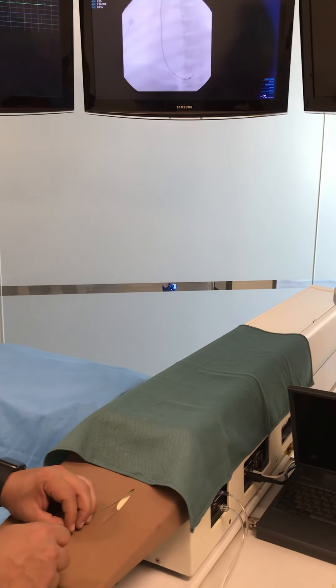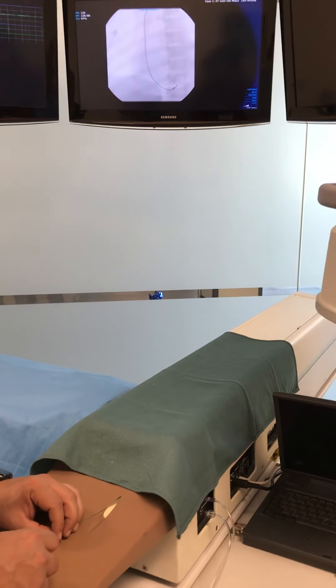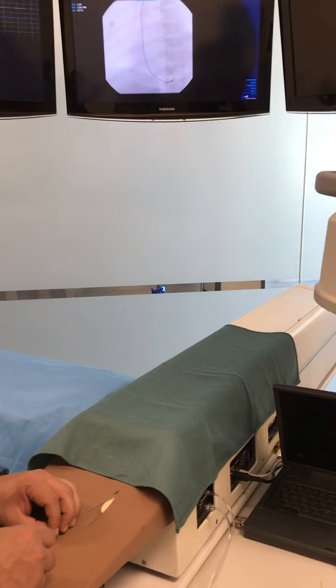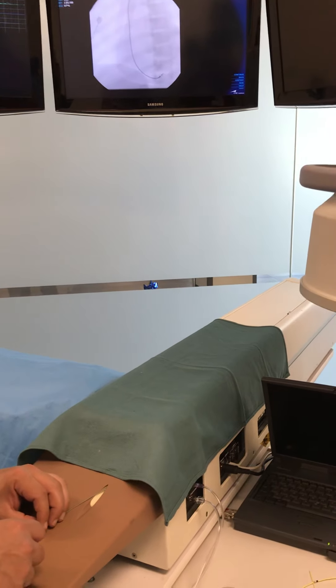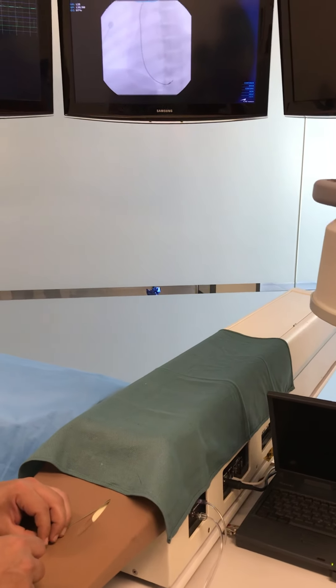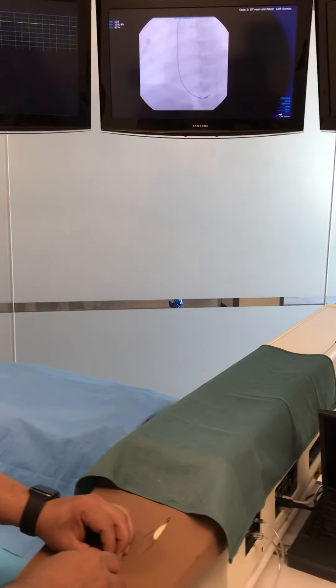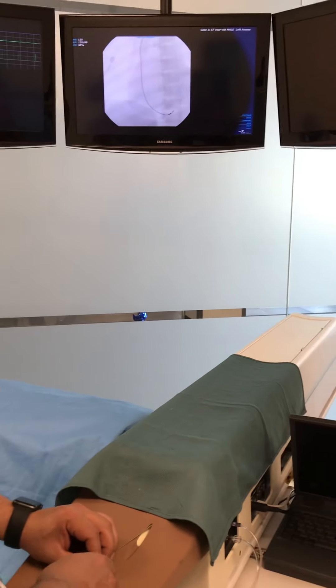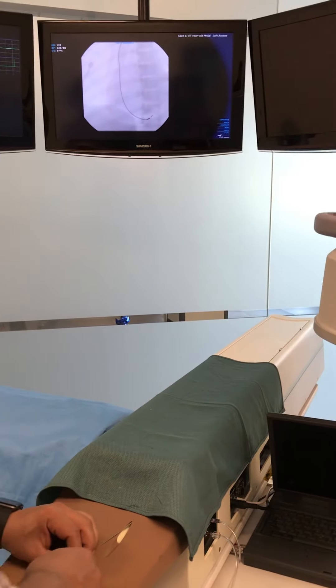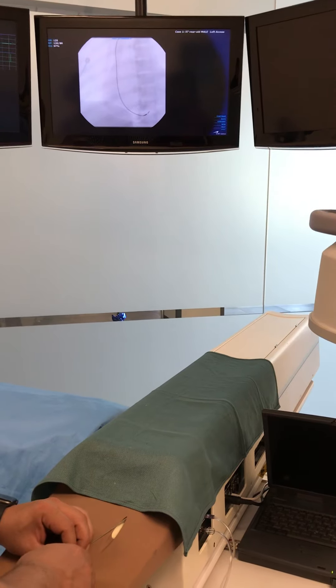So I'm LAO 30 here. It's pointing to the septum. This is a loop. That's LAO, right? It's looking at it this way now.